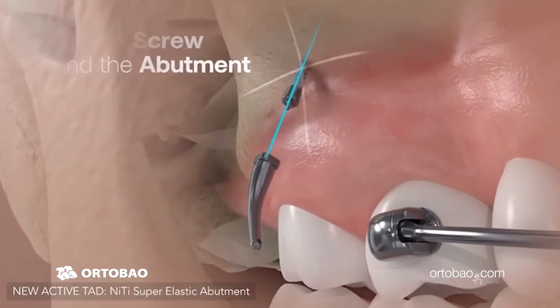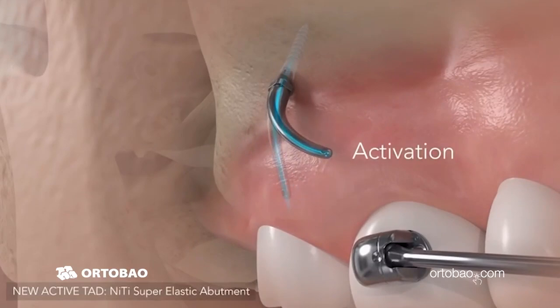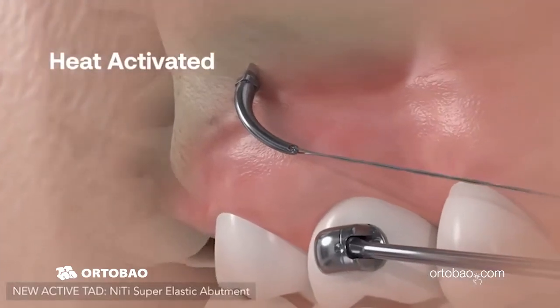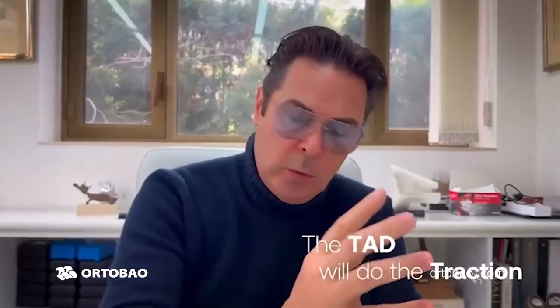This abutment is going to be a section with a special shape made of nitinol, with a certain thickness, and this thickness of this super-elastic material will give us the possibility of moving the TAD from a passive standpoint into an active player in the orthodontic treatment, as the element to do the traction. The TAD will be the one that will do the traction.